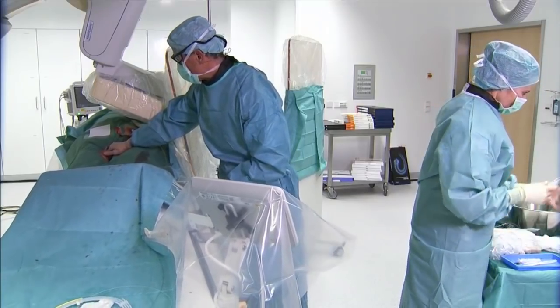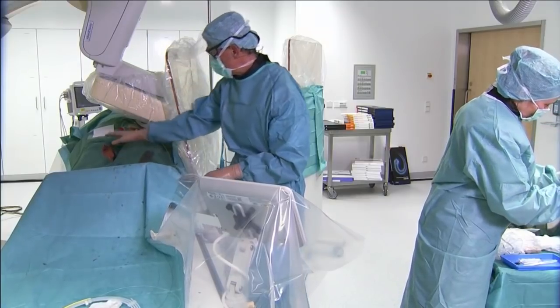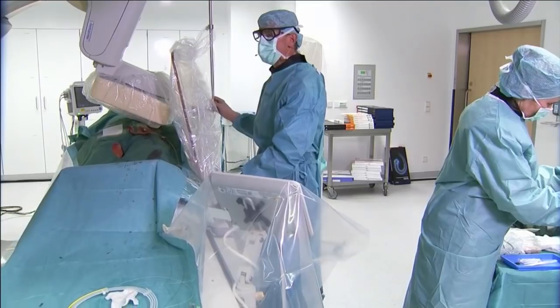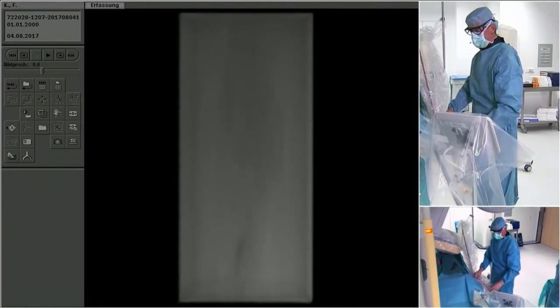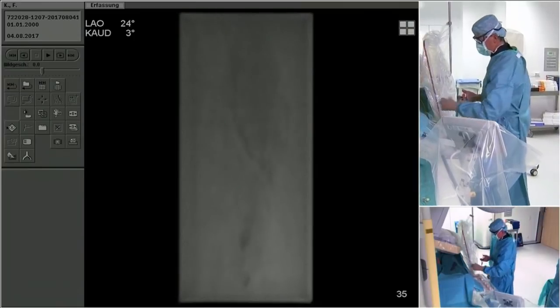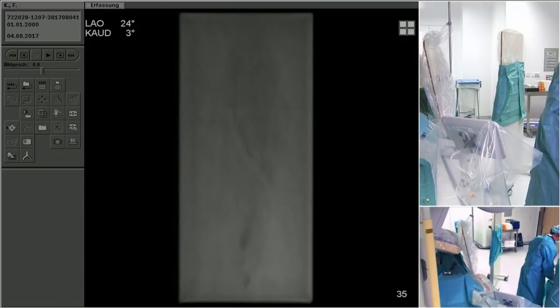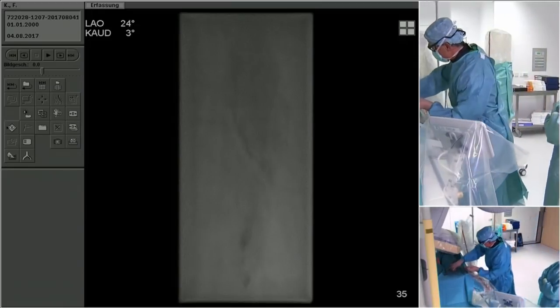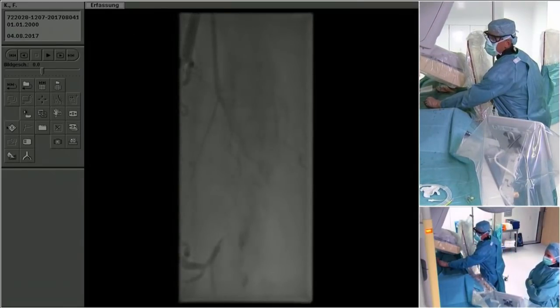Why would you not try endo first, Munier, given that the groin has been transected twice? Why not give it a try? Because I don't think he's taking the surgical option out by doing this so far. You don't have to go through the same scar. You can go a little bit distal, find the SFA, and connect them with the graft. Then do the rest of the artery endovascular, so it will be a hybrid procedure.